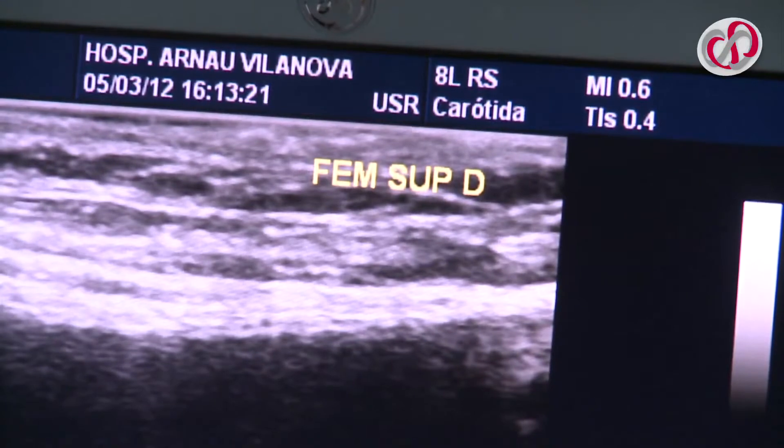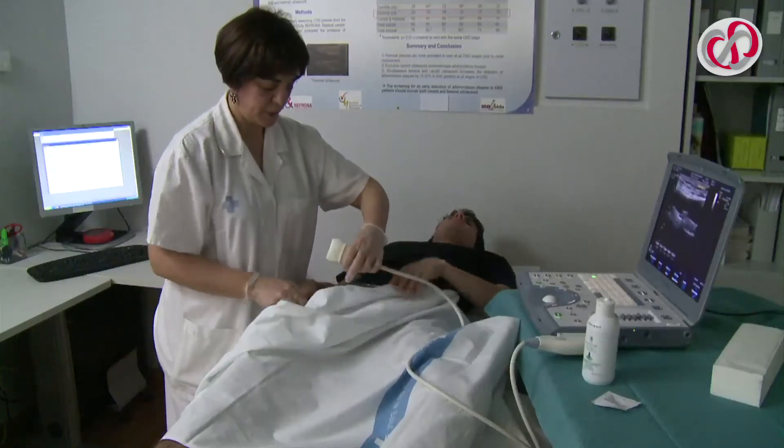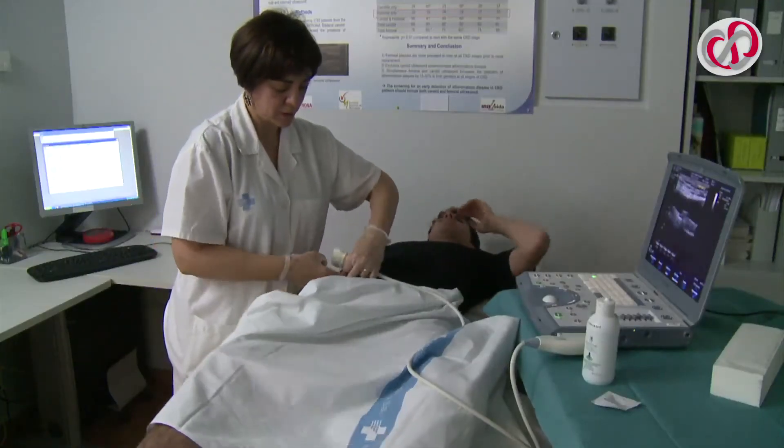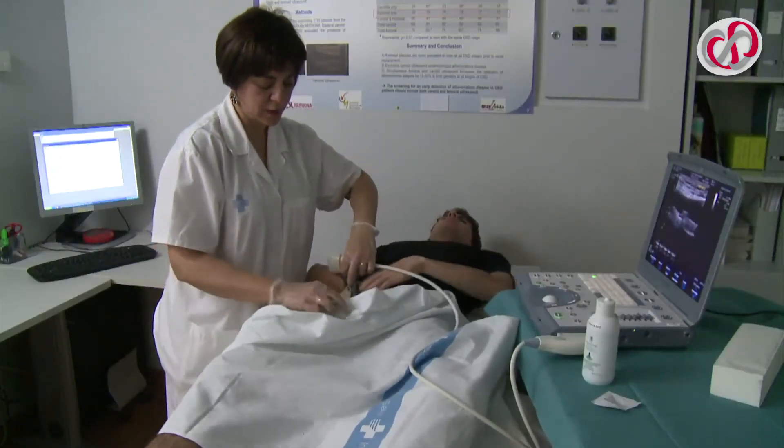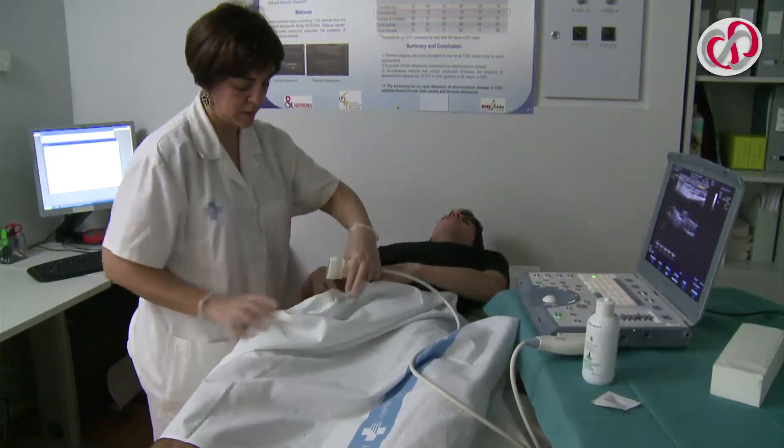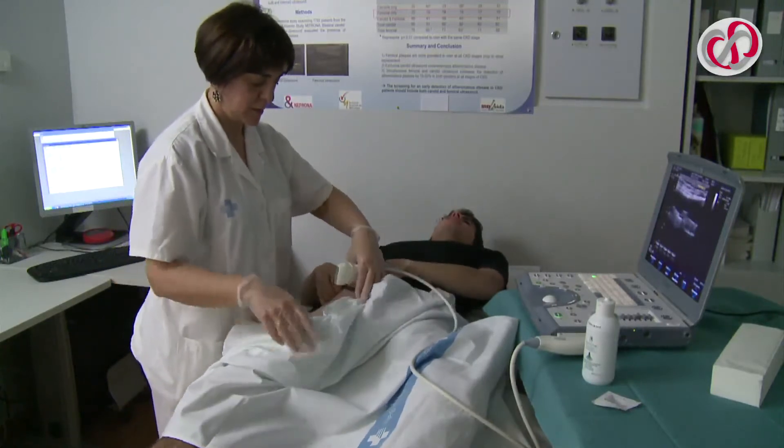We repeat the process for the other limb. The data obtained is collected and saved for posterior analysis.